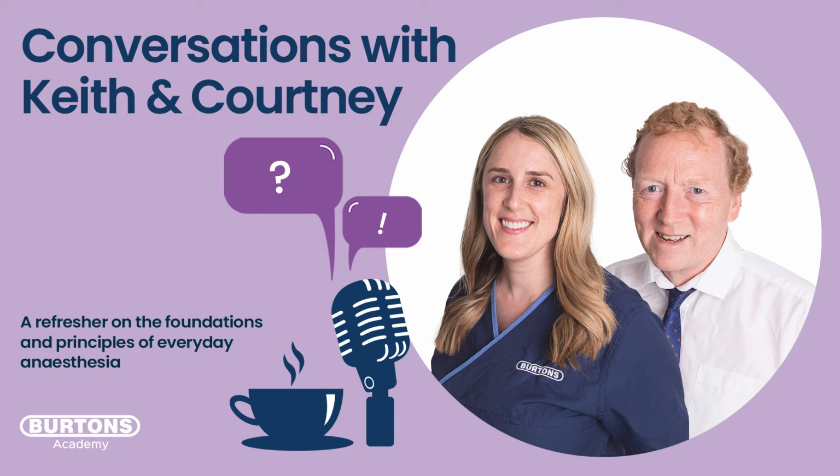So shall we say we've got an animal that needs a minute volume of 1 litre per minute, and we're on a T-piece, so it should be at 3 litres a minute, but say it's set at 2. What could happen there if the animal's breathing rapidly? In other words, there's no expiratory pauses. It'll breathe in, it'll breathe out, and then as it breathes out, some of the fresh gas will start pushing it down the expiratory limb, but it's going to breathe in again very quickly.